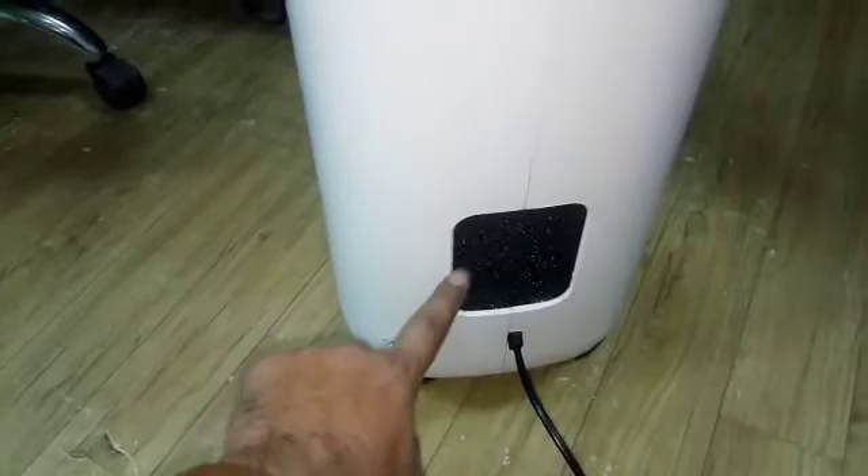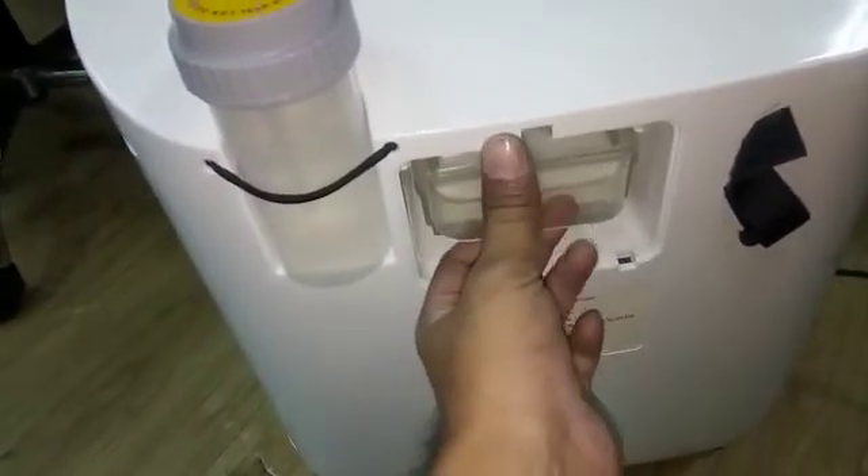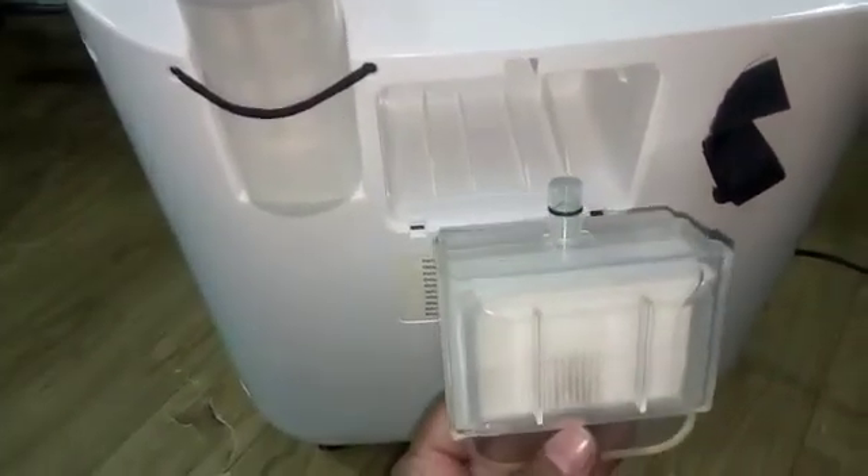This is the air filter. This one is the internal filter.